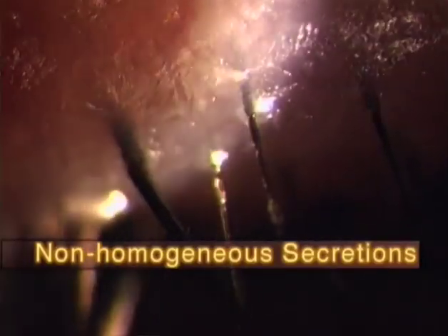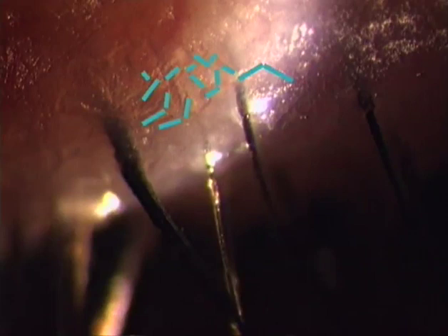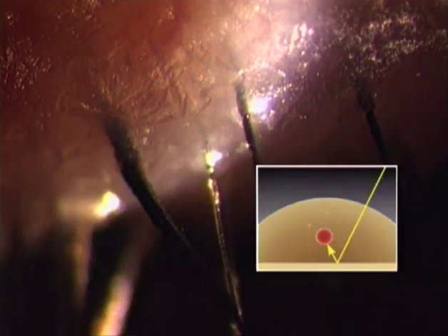In contrast, non-homogeneous material is crumbly in structure. When dry, its surface is irregular. It may fracture, and thus crusts on the skin may have irregular polygonal outlines. Any otherwise invisible margins can be made out by refraction phenomena in indirect lateral illumination. When dry, non-homogeneous secretions surrounding the shaft of a cilium form whitish-yellowish crumbs with irregular surfaces.